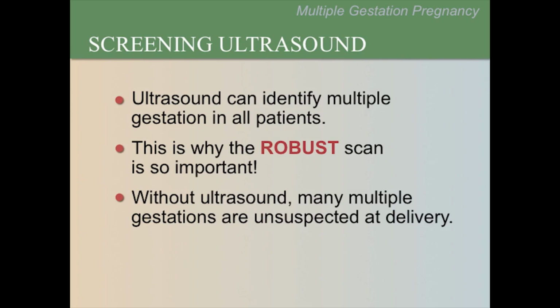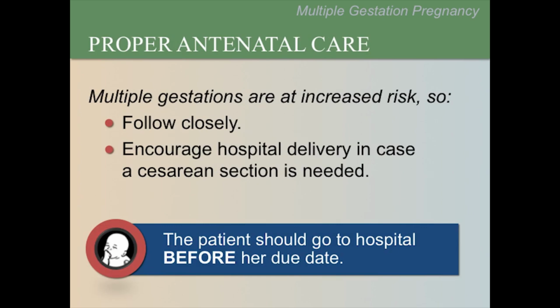This is why the robust scan is so important. Without ultrasound, many multiple gestations are unsuspected at delivery. Because of the higher risks to the fetuses and mother, multiple gestations need close monitoring.